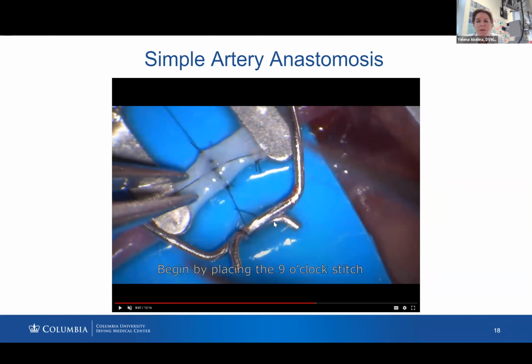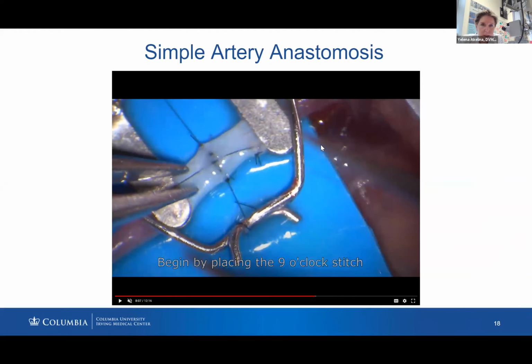Also, when you're taking courses like this, this is what you learn. I can't tell you exactly the distance because the vessel could be different. So I would say 0.5 millimeter. You can see on this vessel what the different distance is.